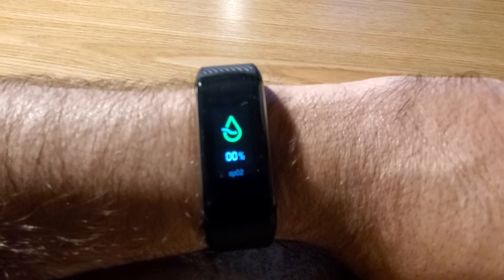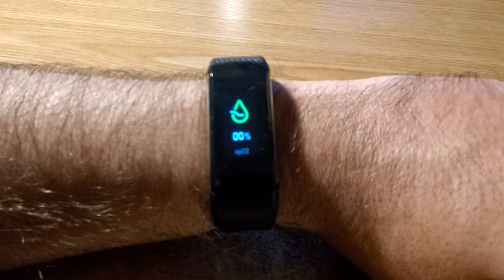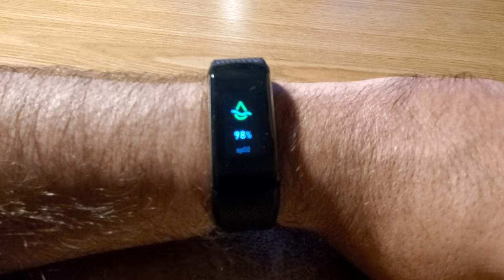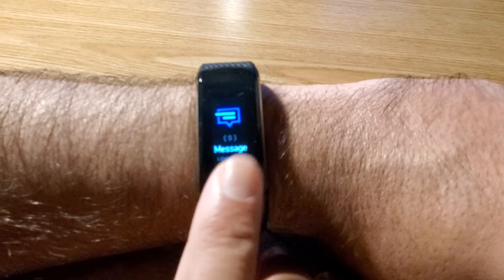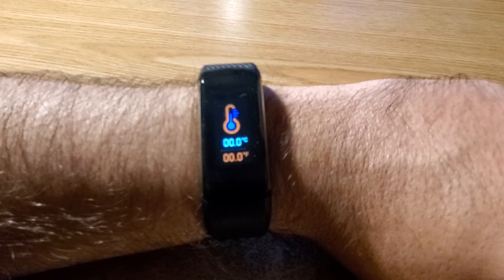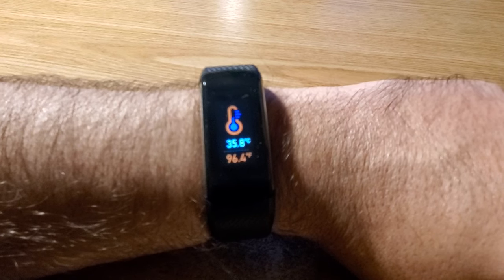Now we can go to the next one, which is your SPO2 — just wait and it'll do a measurement: 98%. Next is your body temperature. Keep tapping the screen until you see this icon; you don't have to press anything after that, just wait — it does the measurement automatically when you're on this screen. Result: 96.4 degrees.